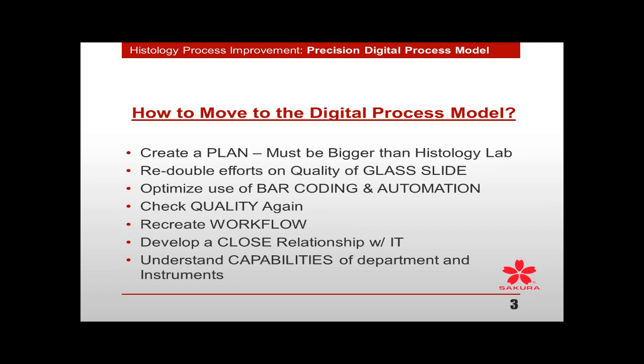Recreate your workflow. We're going to talk about that a little bit more. I've just got some simplified workflows, but it seems simple enough to put digital in, but you've got to be working in a different flow so that you can incorporate the total time process required for digital. Develop a close relationship with IT. You're going to have to understand a whole bunch of new terms. You're going to have much, much closer relationships with IT, because you're asking to use a lot of the network and the systems that sit out there.